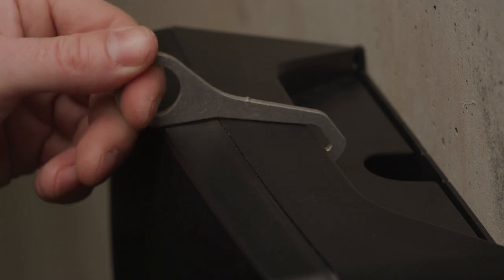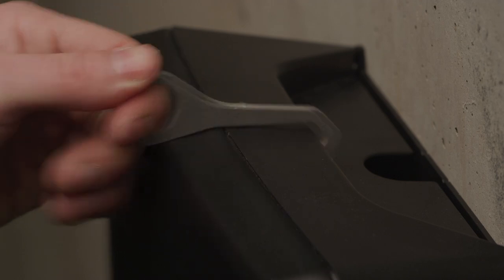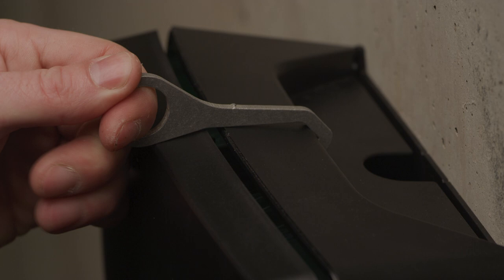Attach the Smart Key to the top of the cover. Pull the Smart Key towards you until you hear a click. Tilt the cover off as shown here.